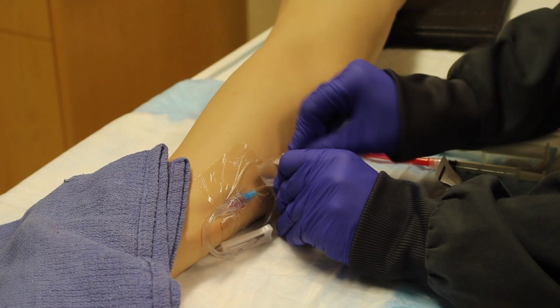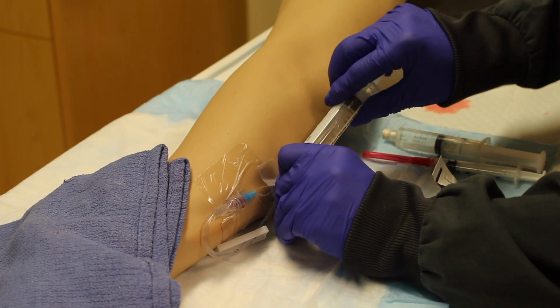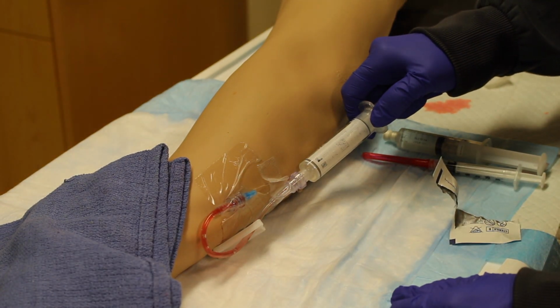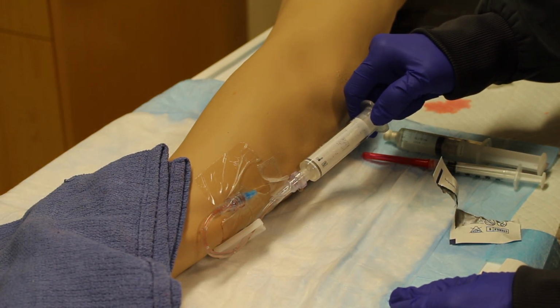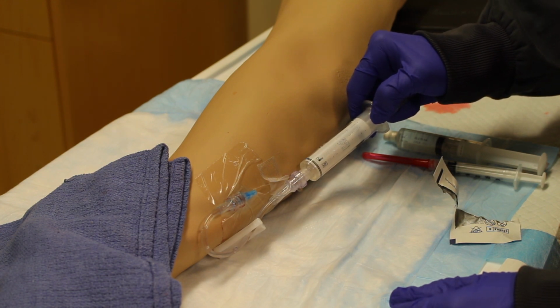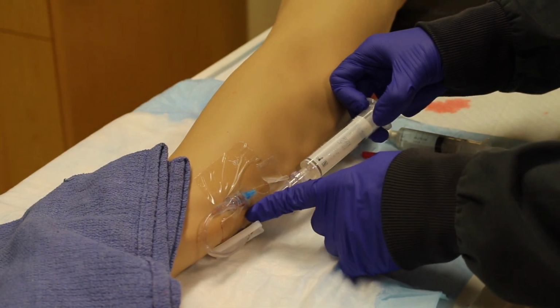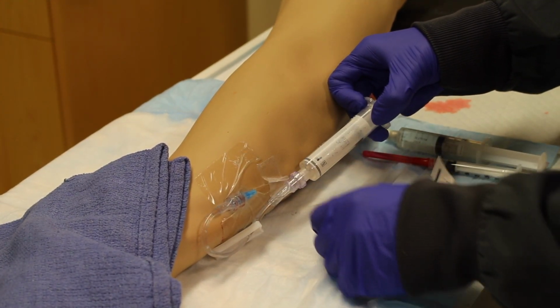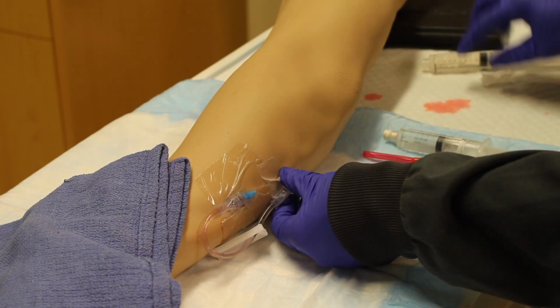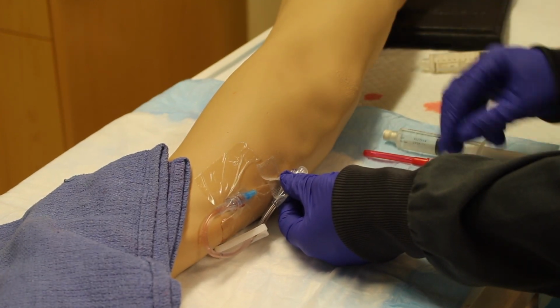Insert the flush syringe. Assess patency and aspirate for blood return if required for the connector piece. You will be looking for swelling, inflammation, pain or discomfort when inserting the flush, and also just observing the integrity of the IV. If it is patent and you're good to go, go ahead and scrub the port again. Attach the medication syringe and slowly inject the medication according to the IV push rate.